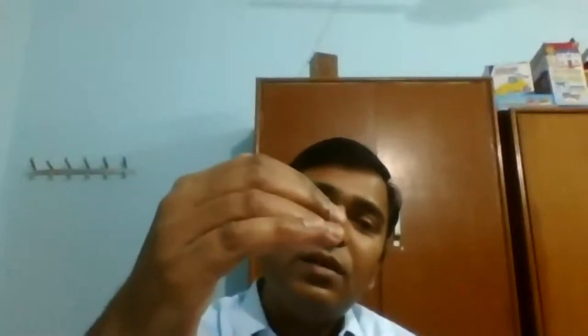Actually, when the dialysis is less than 2 clock hours, you can put the haptic in the direction of the dialysis. So you can use the 3-piece or the PMMA hard lens very easily.